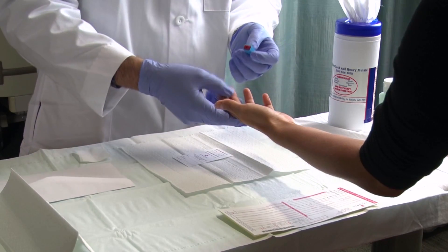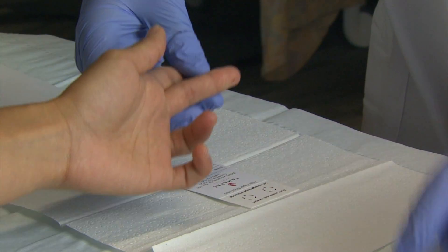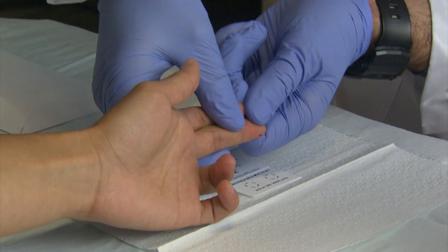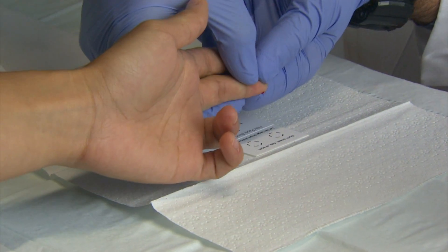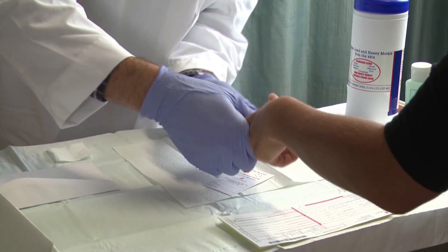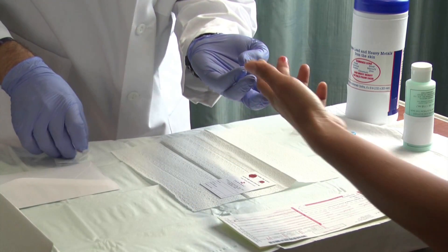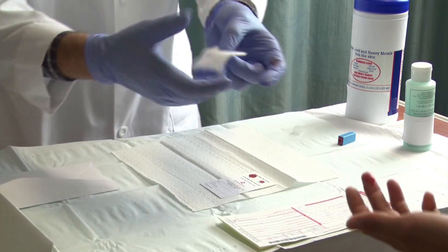Remove the filter paper card from the plastic bag. Allow the first drop of blood to fall on the first dotted circle. Allow the second drop to fall on the second dotted circle. A third drop could be collected if the first two are questionable.